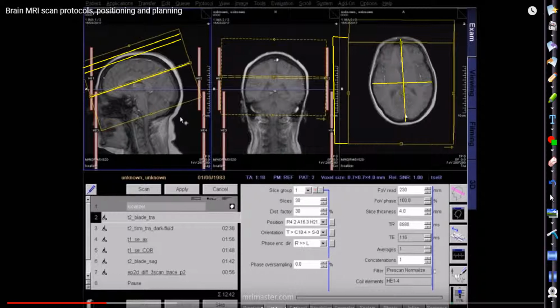Those basically look like extra little rectangles on the edge of the anatomy. If you want the thorax and you don't want the arms to wrap in, that's a perfect example.